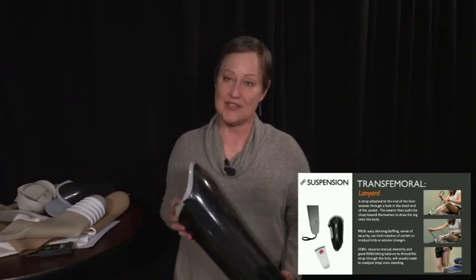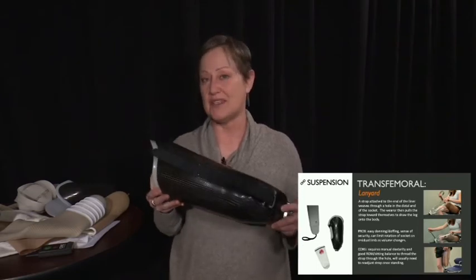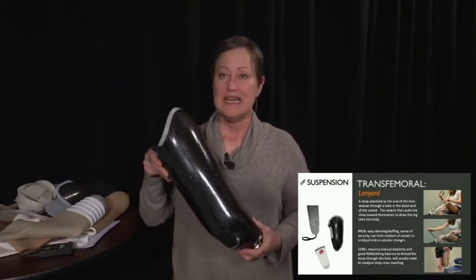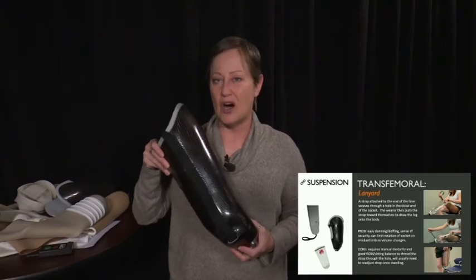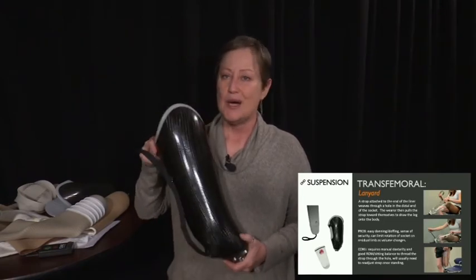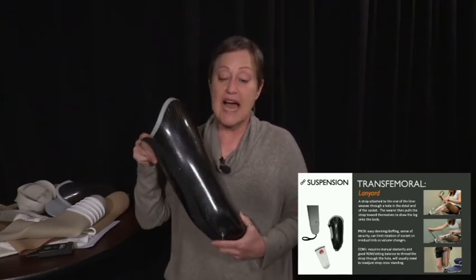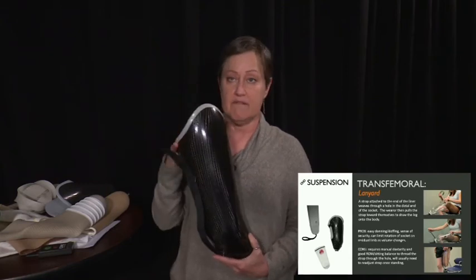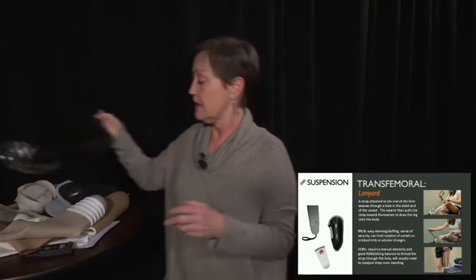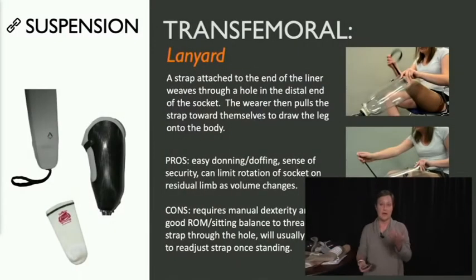So those are some challenges. However, for the pros, for the people who are able to don this, it's pretty secure. People know it's on and it's not going anywhere. And you might have a little rotation of the socket on the patient if they're losing girth of their residual limb, but the lanyard reduces some of that because it can't go very far. So that's one of the benefits of this. You can use regular socks also with the lanyard, which I think really allows you to adjust for the size of the residual limb.